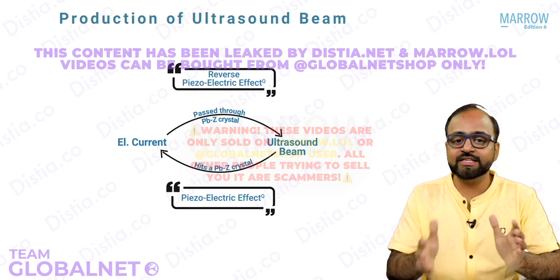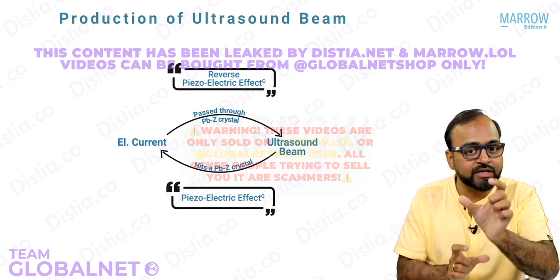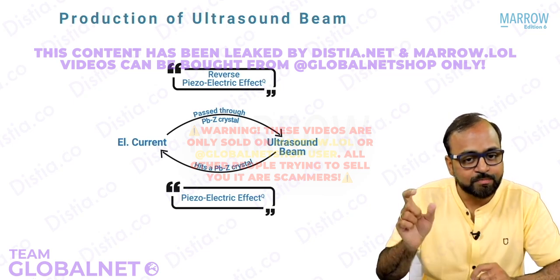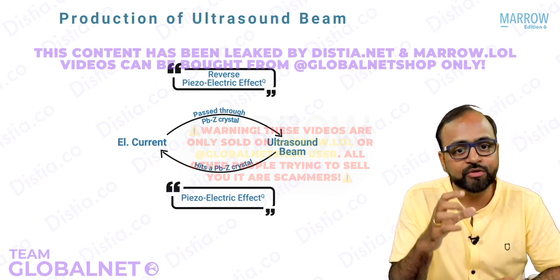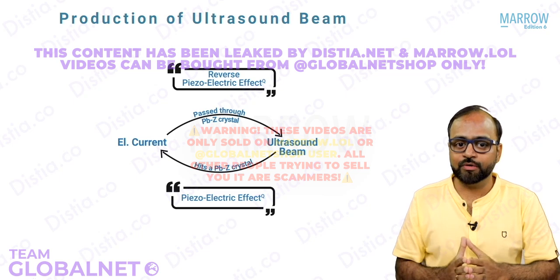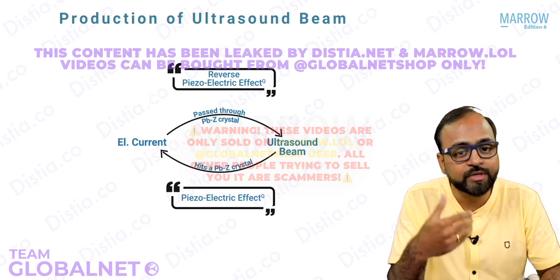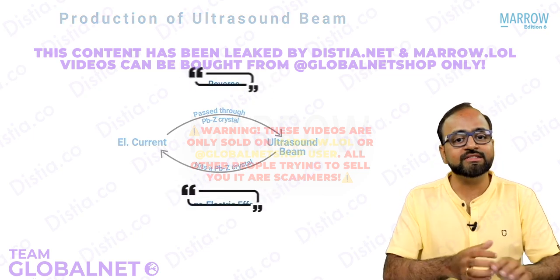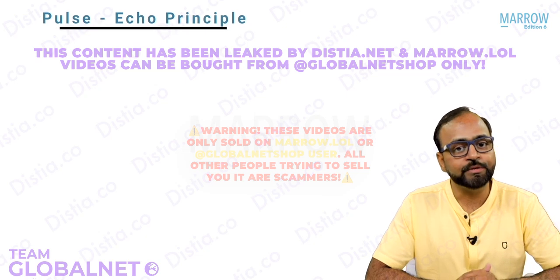Right? Remember, when I say that the piezoelectric effect is the basis of ultrasound, remember that both parts of this particular process, that is the piezoelectric effect and the reverse piezoelectric effect, are used in medical diagnostic ultrasound. How are they used? What is the basic principle on which the image reconstruction occurs? Let us discuss this. This is what is called the pulse and echo principle.